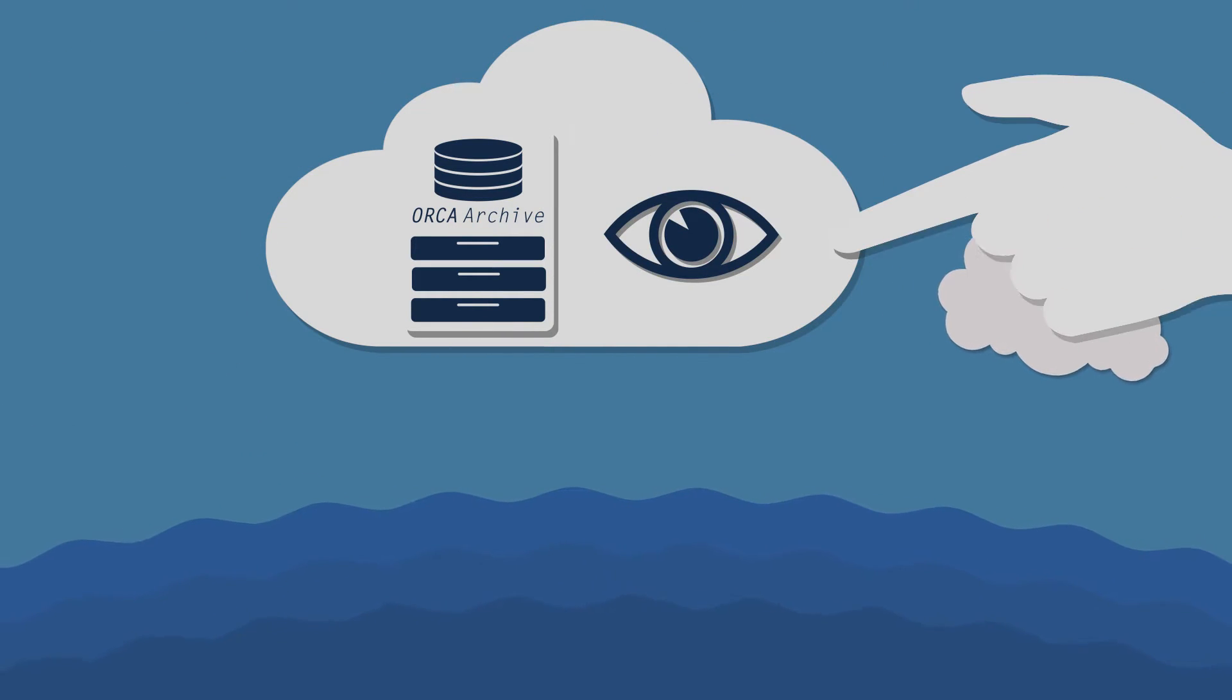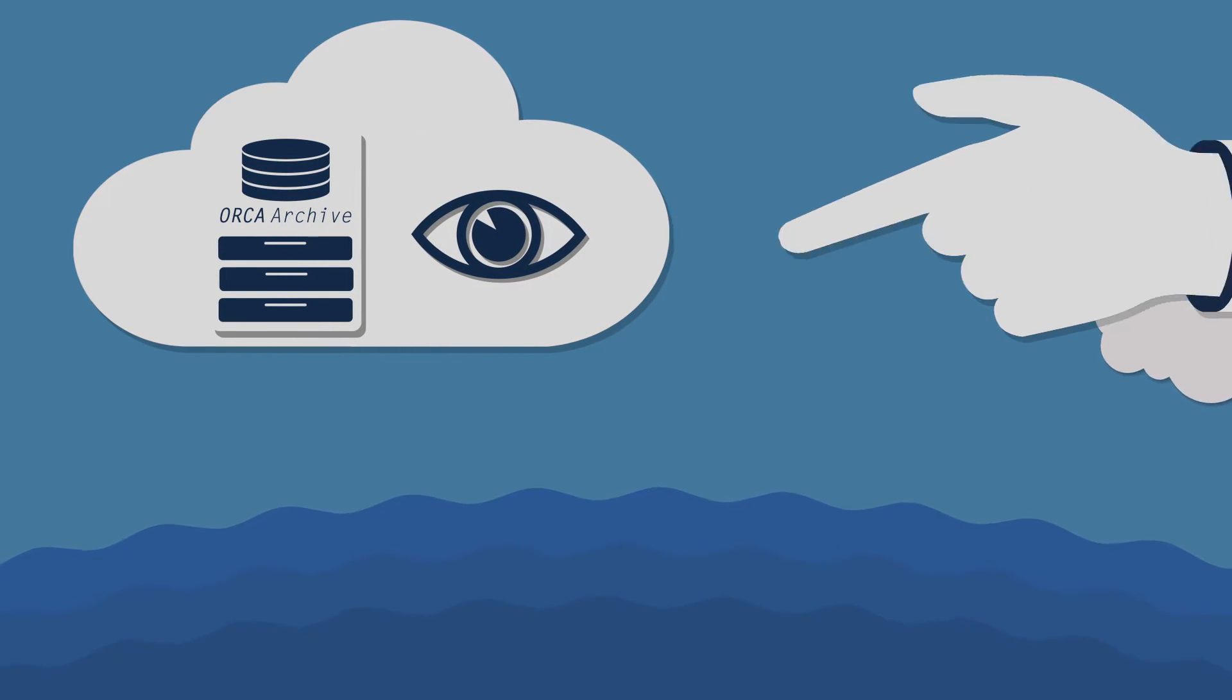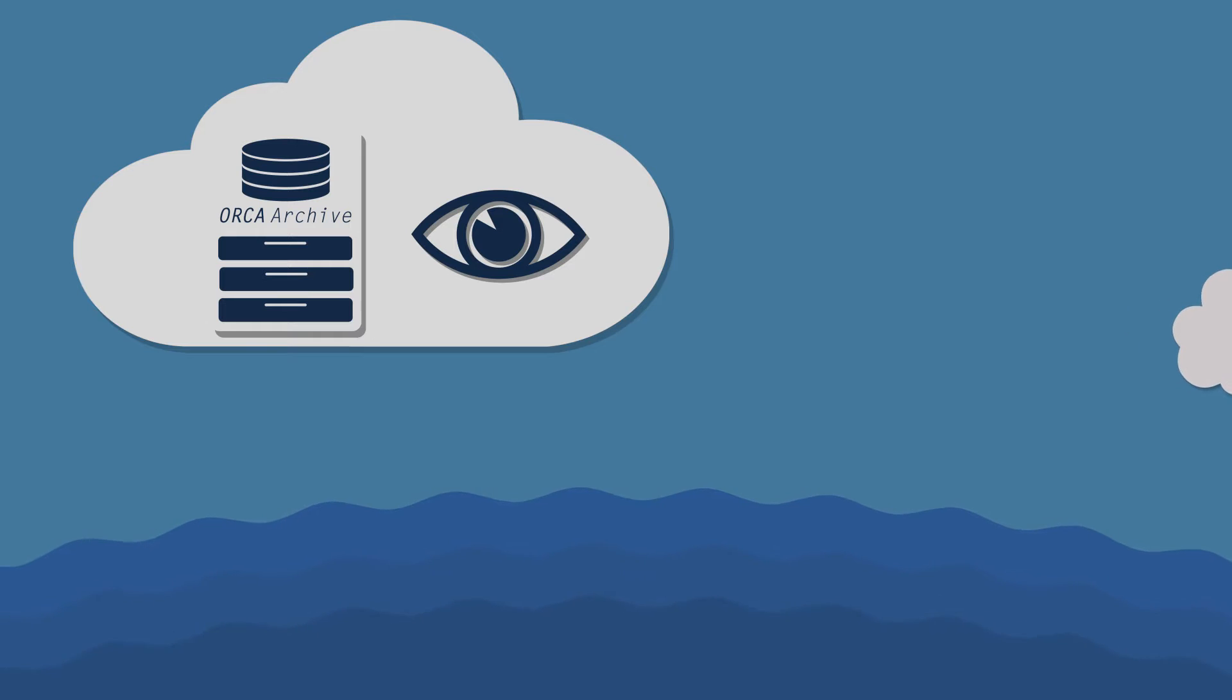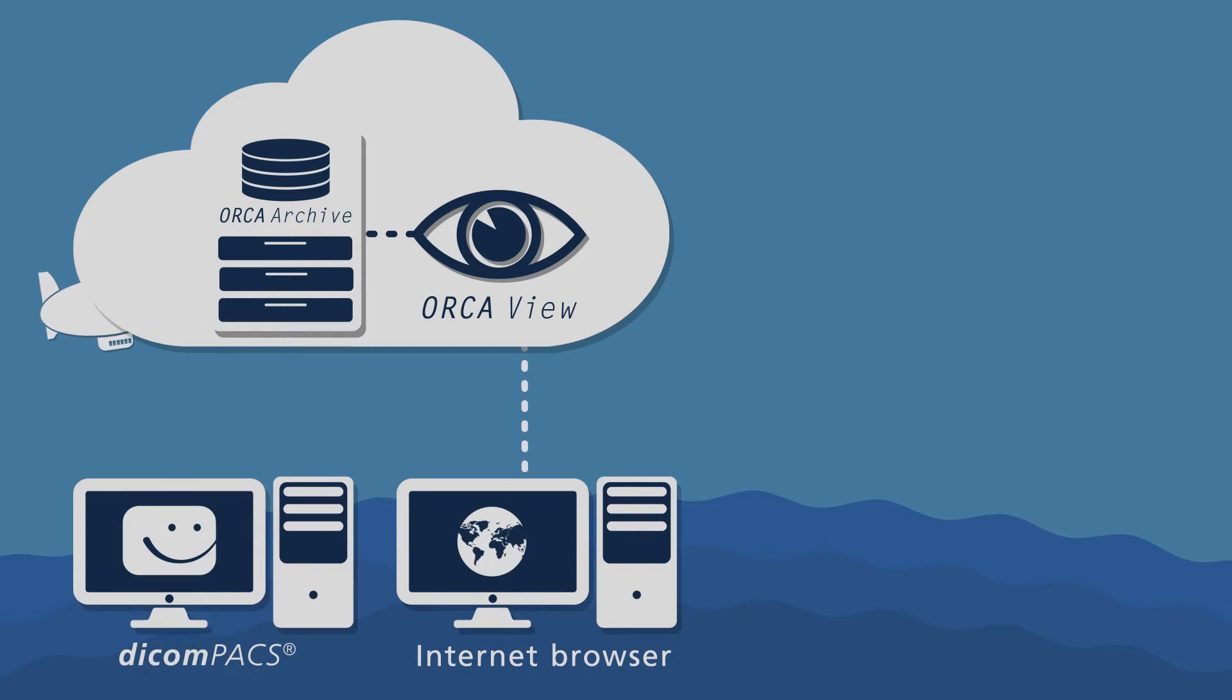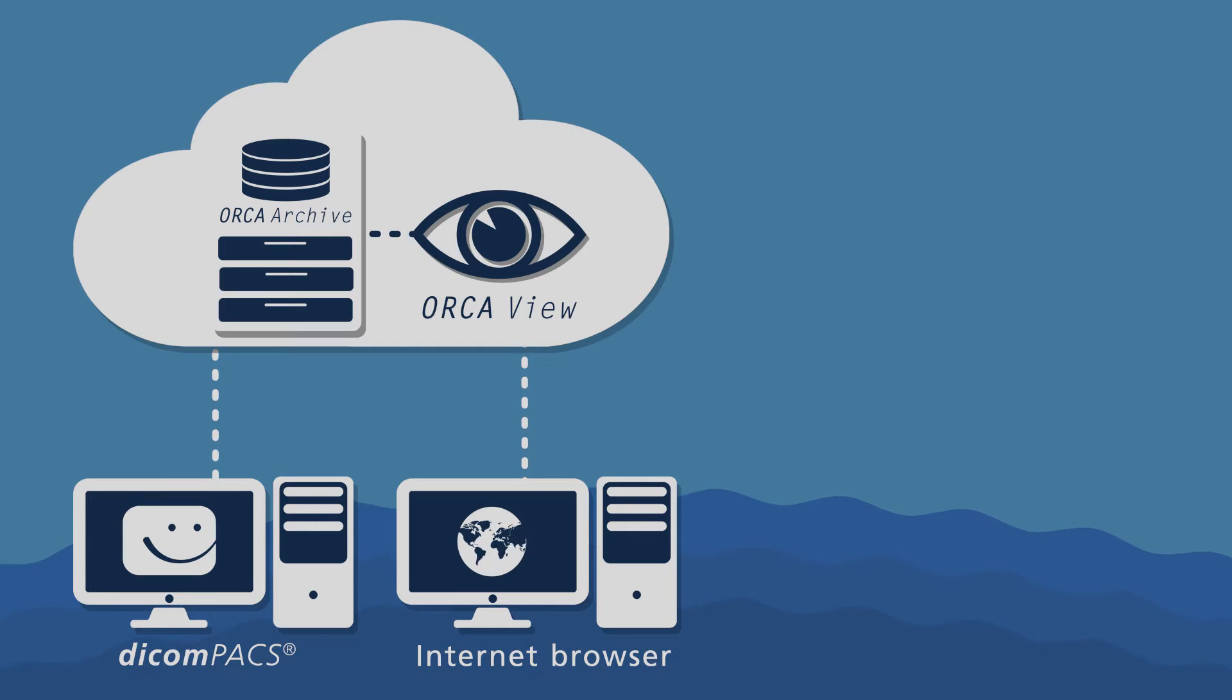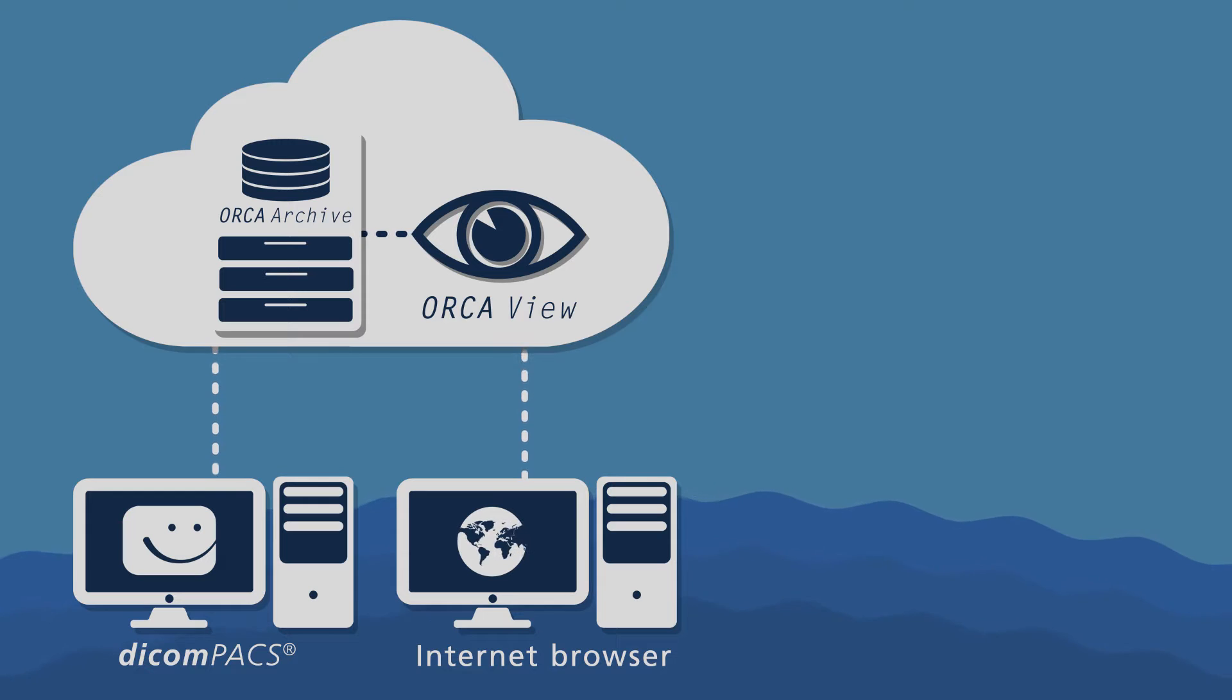When connected to the internet, images stored in the Orca cloud can be viewed at maximum resolution and with DICOM quality via the browser-based Orca View program and our DICOM PACS image management software.